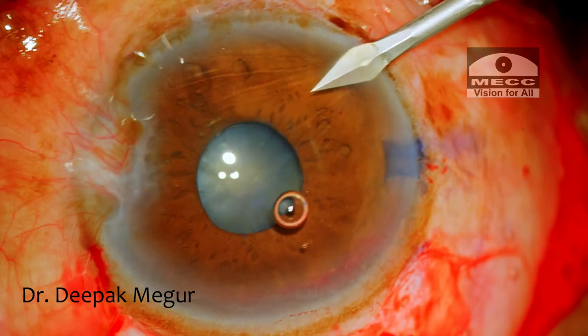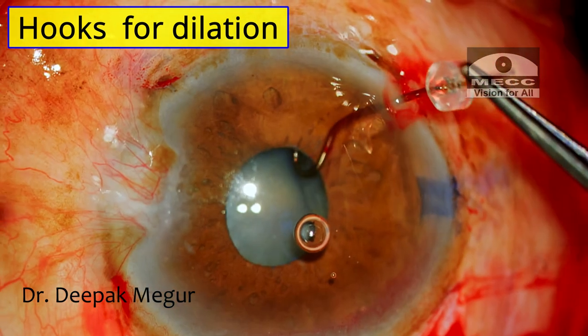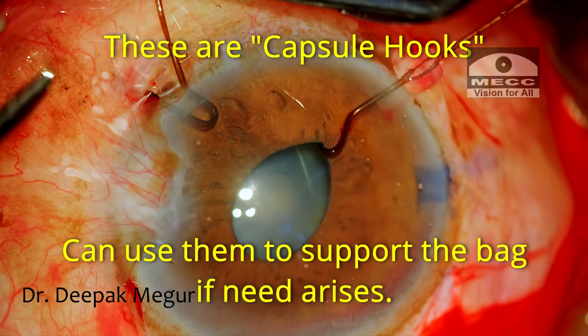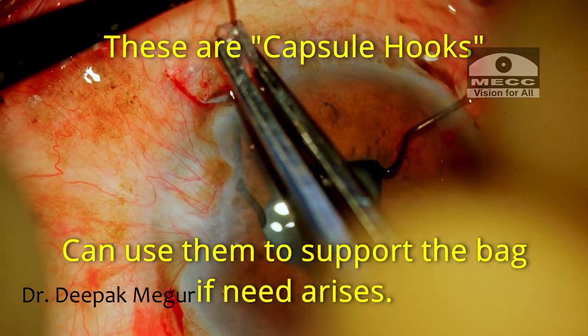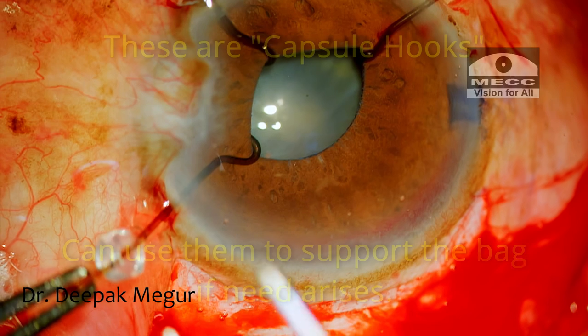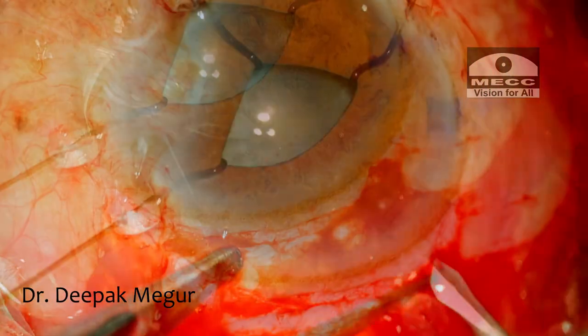I begin by making the posterior limbal paracentesis incisions. I'm using these hooks to stretch and dilate the pupil. These are not iris hooks — they are capsular hooks, and my plan is to use the same hooks to engage the capsular bag if needed because of the loose bag. I've made four paracentesis incisions for the hooks.